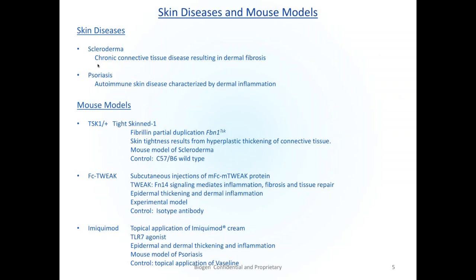So this was using tools that we had developed in-house with a pathway that we understood well. There were numerous other studies that had been done interrogating tweak FN14 biology in numerous ways. This was unusual because this was done really focusing just on the skin. So I'll get back into some more details of this. But we found this to be quite an interesting model with a very interesting phenotype that we could see by ultrasound. The third model that we were looking at I will refer to as the Imiquimod model.